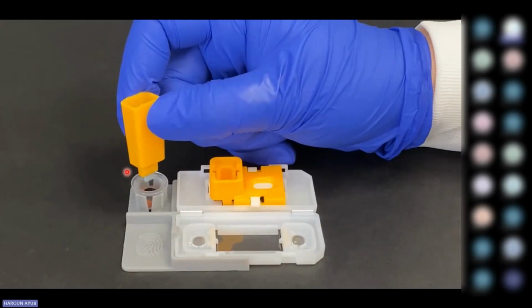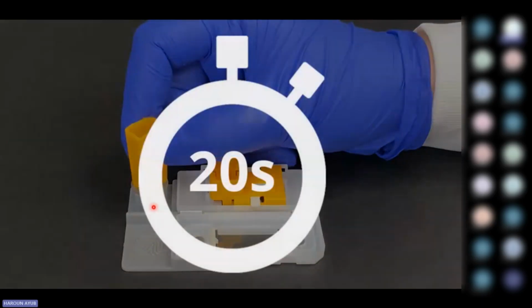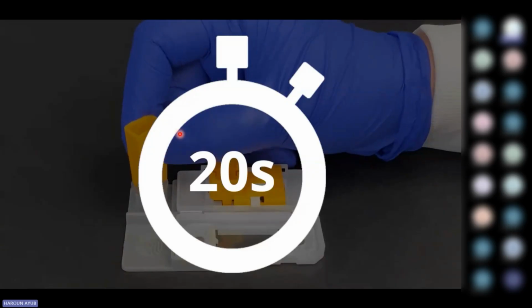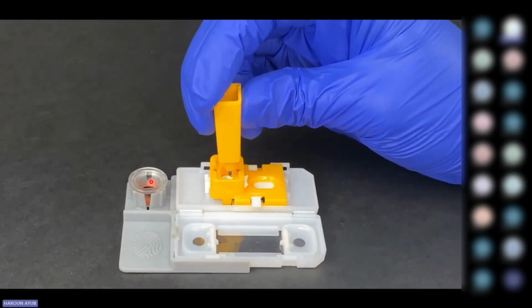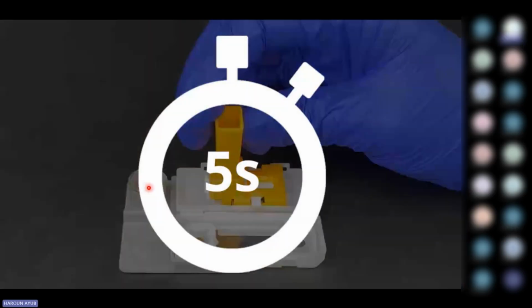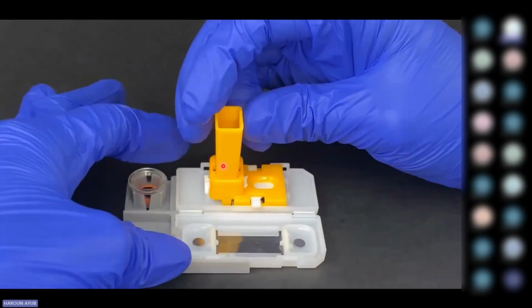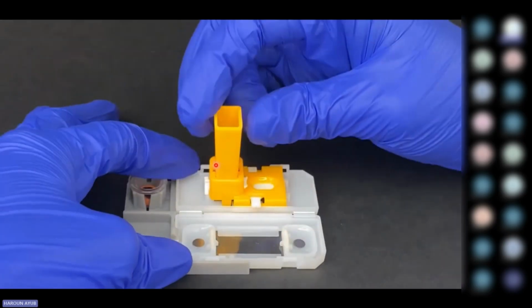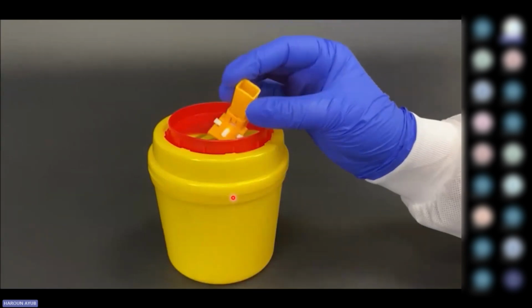The pipetting or vortexing that we were doing using a pipette or a vortexer is simply represented by the up-down motion. This is just the mixing of the blood and the marker fluid. This is the stamping method, which gives us a calibrated amount of the marker and fluids on the paper strip.